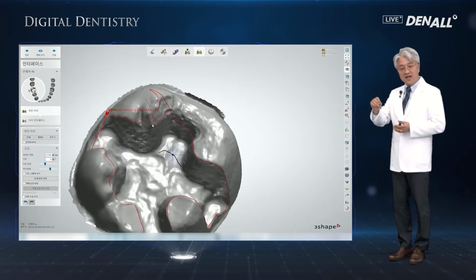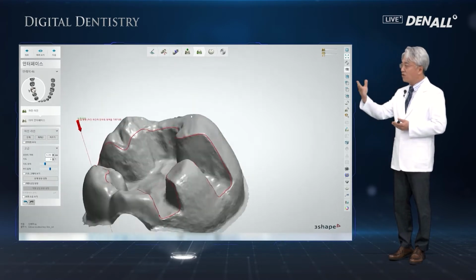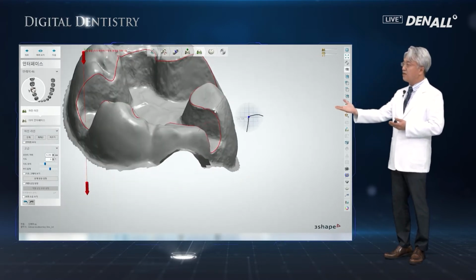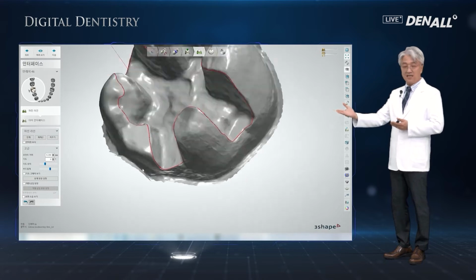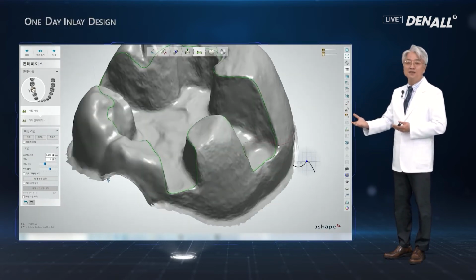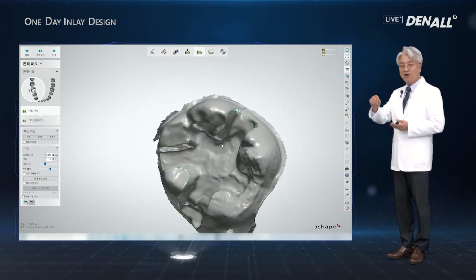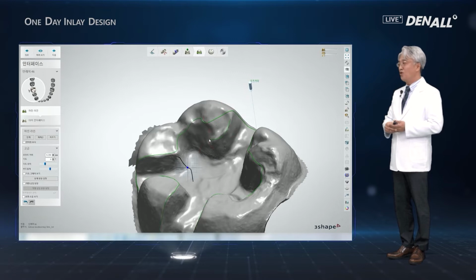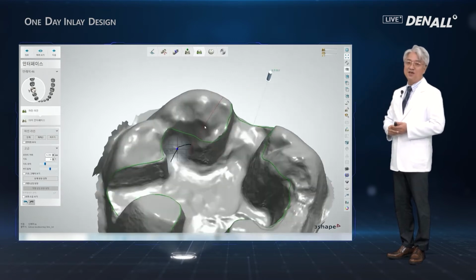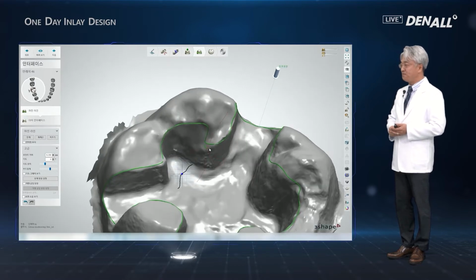And if I do this process myself, then I can also do the prep much better. So the preparation, I think, has gotten better thanks to the CAD-CAM because I start with the CAD-CAM first. Using handpieces has become better for me also. So I think using CAD-CAM has been very useful and helpful for me.